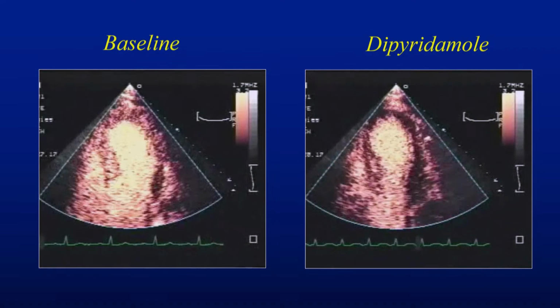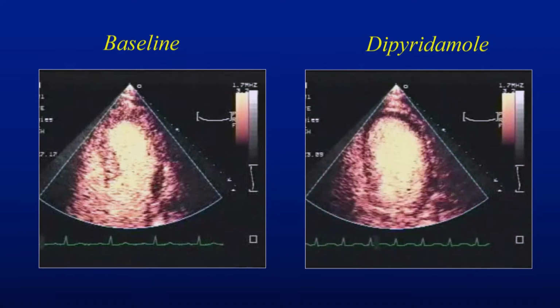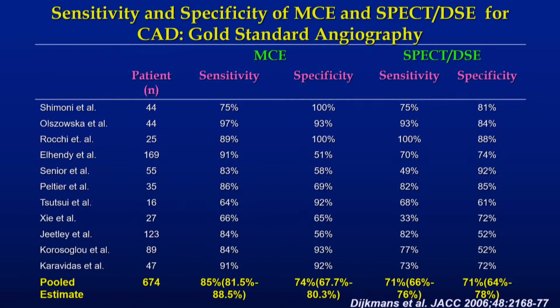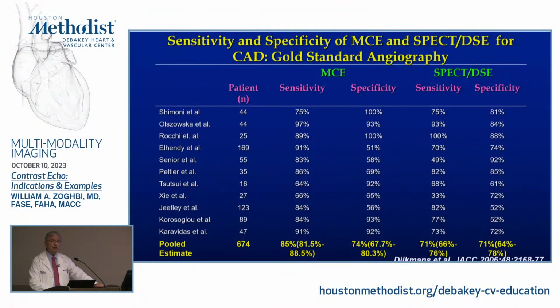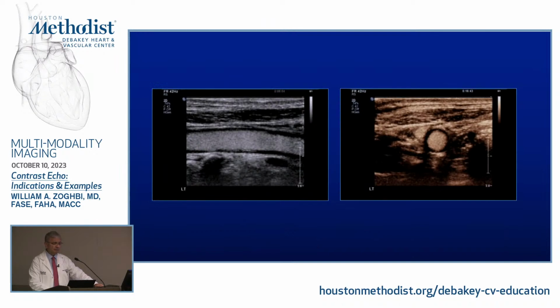A little more tedious than your regular imaging. There are a lot of studies, and we were one of the sites that did quite a few studies. You could see Dr. Shimoni there, number one, and many others. And Dr. Porter, certainly Tom Porter has done and still does quite a bit of contrast. The additive value to wall motion is still a bit questionable at this stage of the game. And we don't have a true indication currently, no indication for it. So we have really not used it in the lab from a clinical point of view.